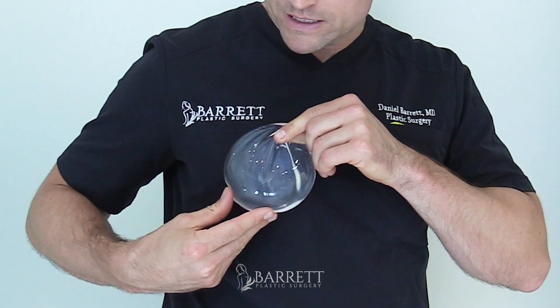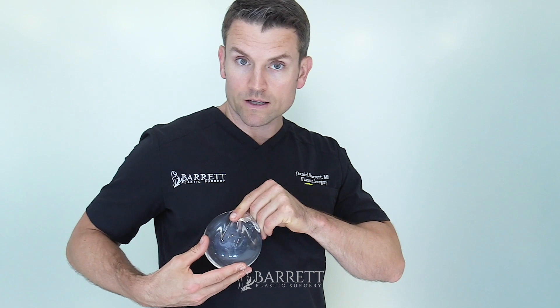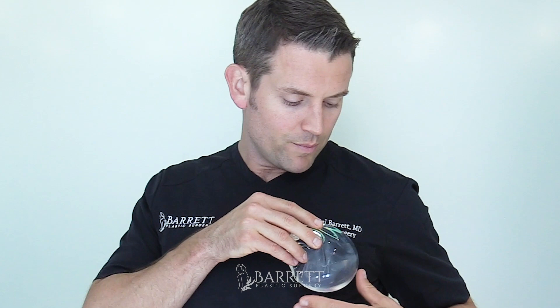This is the movement that you want. Same thing on this side — you're not pinching the breast above, because remember the implant is below. You're pinching the skin and soft tissue around it so that the implant moves in this direction toward the opposite shoulder.